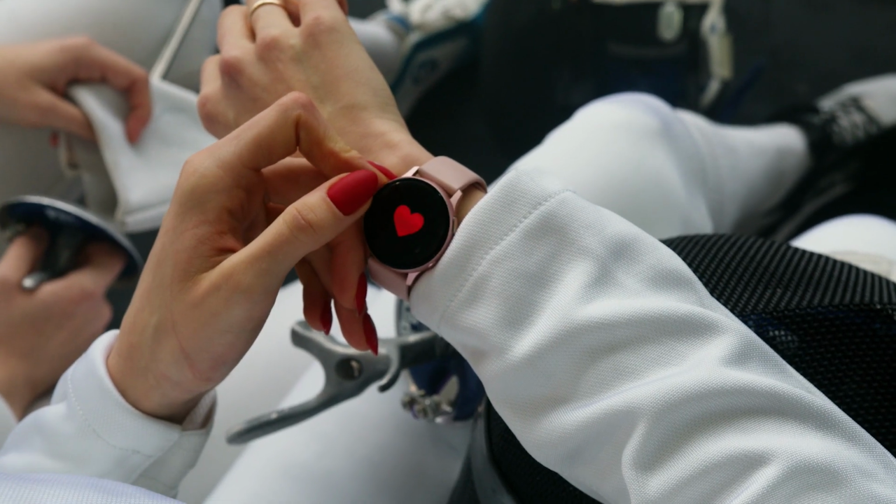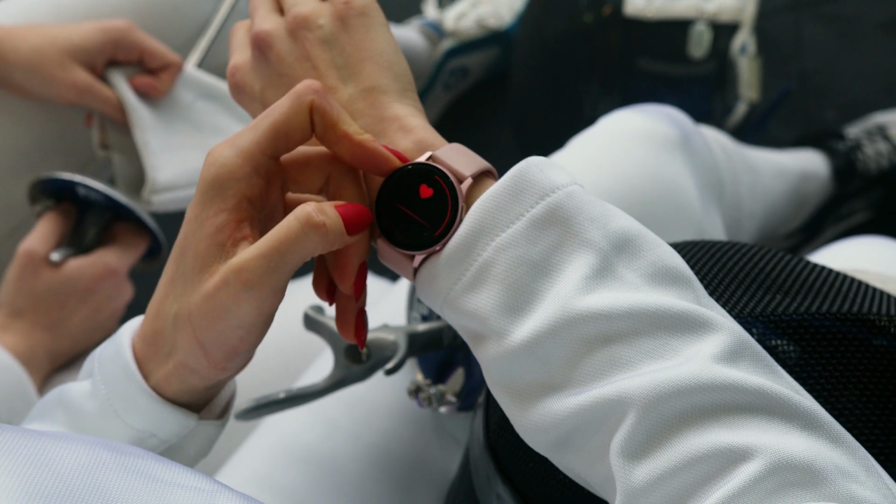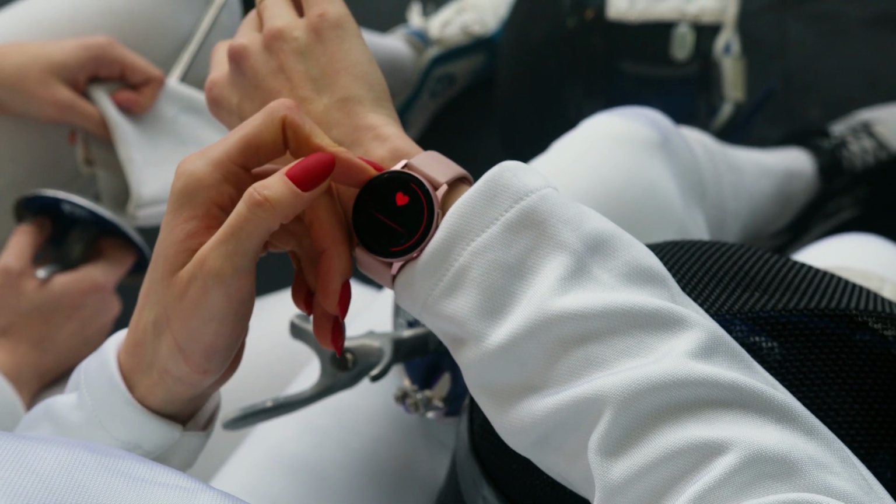The next classification is based on location of wear. The first one will be wrist-worn devices. Smartwatches and fitness trackers are examples of wearable devices worn on the wrist. The next one will be clothing embedded sensors. These are sensors integrated into clothing such as smart shorts or sports bras.